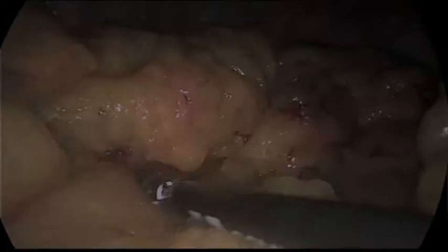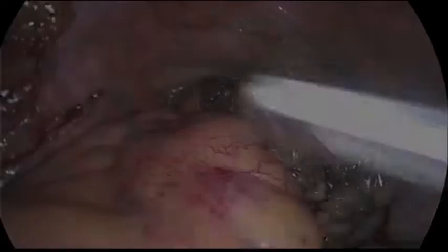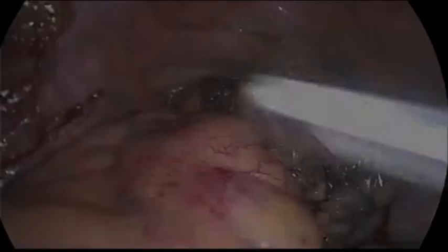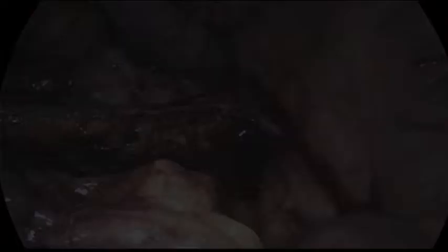Here you see our mobile left colon specimen. We then turned our attention towards mobilizing the rectum. Here you see the small bowel specimen left en-bloc on the rectum. We performed a total mesorectal excision, using tension to expose the correct planes for dissection.